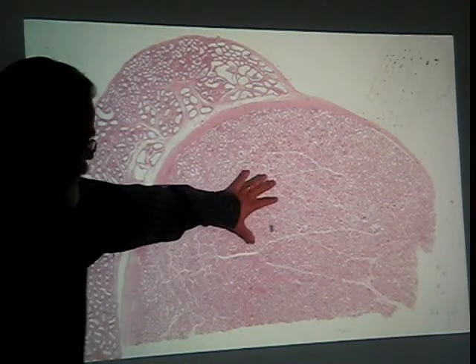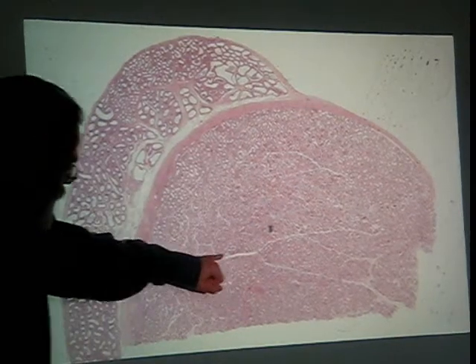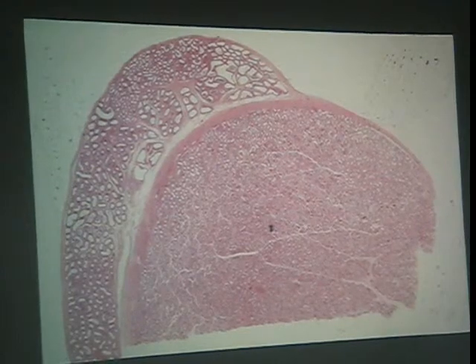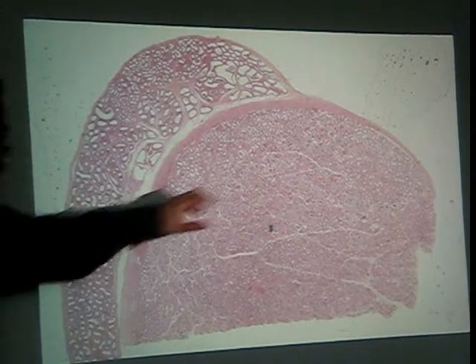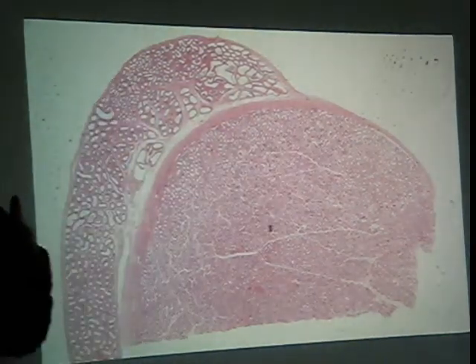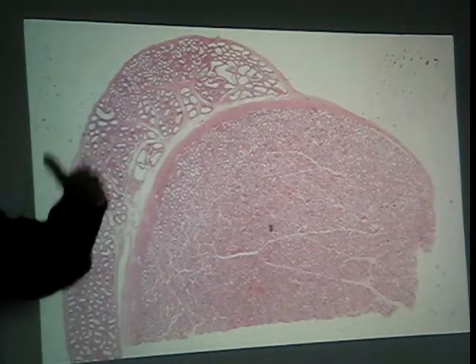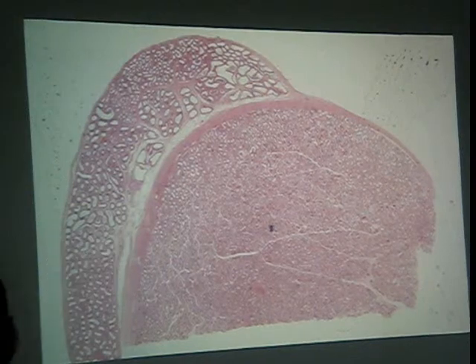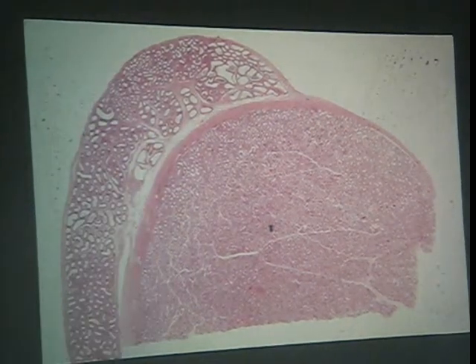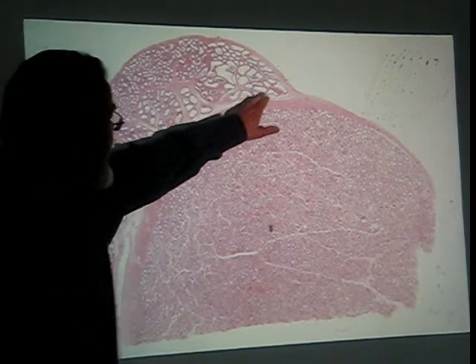But you can see clearly the seminiferous tubules, these connective tissue partitions dividing the testicular parenchyma into lobules. You can see the tunica albuginea. Whether or not you have the vaginalis, which would be a mesothelial lining adherent, depends on processing. Probably not see it. Come back here into the mediastinum, and you can pick up the efferent ductule.